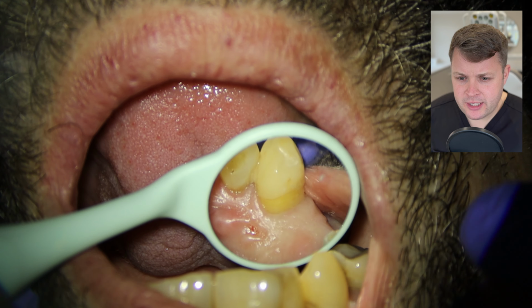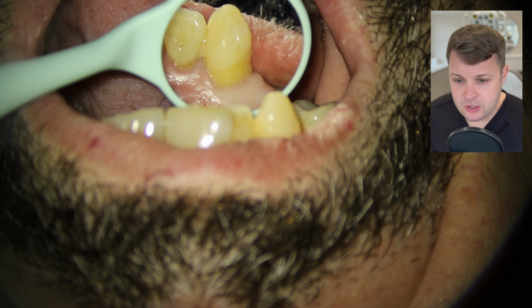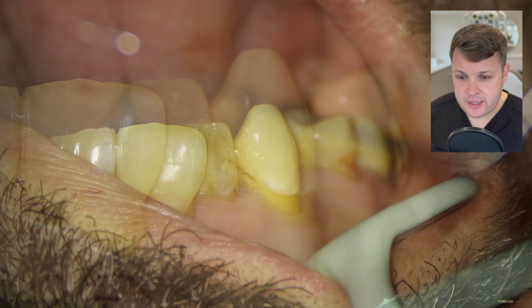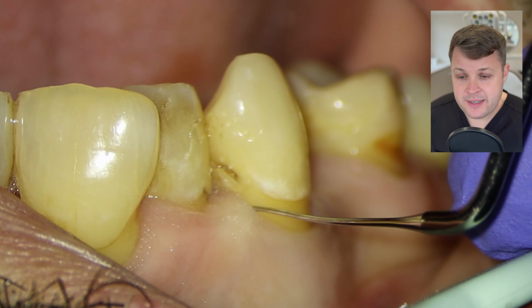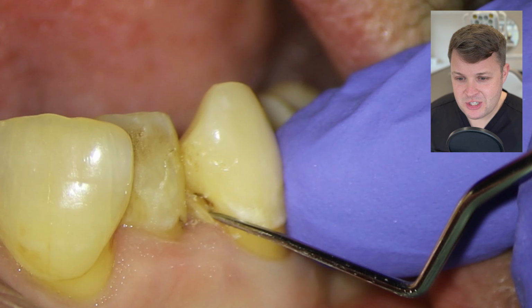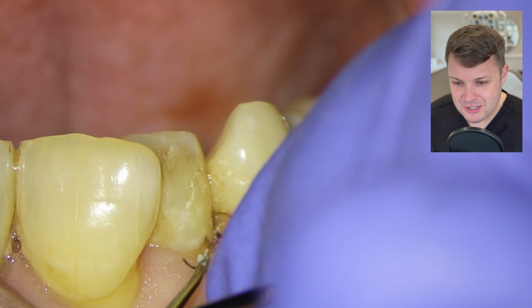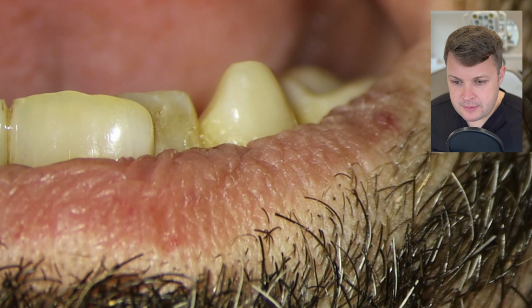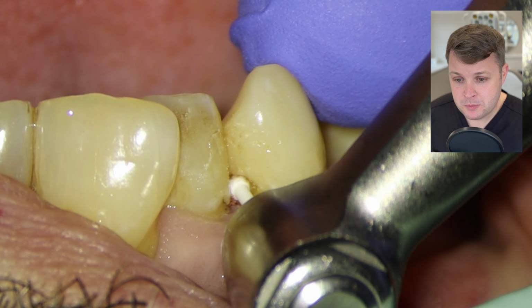Again, I'm looking at the tooth, and I can't really work out why this tooth died off, because it looks seemingly completely intact, but actually when we look at the tooth in the mesial aspect, we can see there's this kind of ditched composite. It's loose, and there's also a bit of decay in there. So what I'm trying to do is use my DG endodontic probe just to try and flick this composite filling out, and I do flick it out, and it's all a bit nasty in there. There's a bit of decay. I'm also feeling around to see if there's actually an exposure of the pulp, but there isn't.